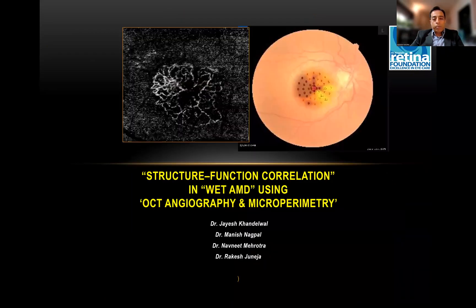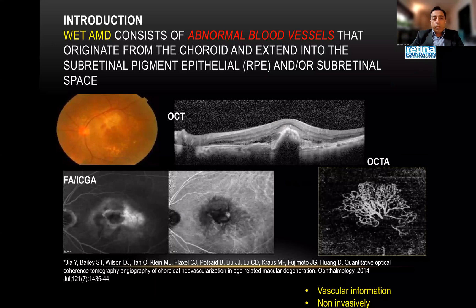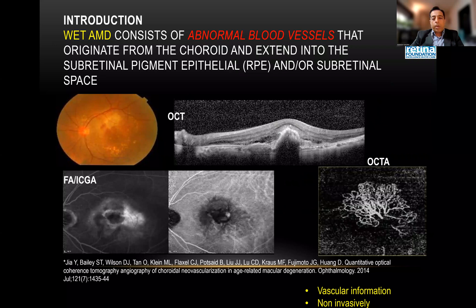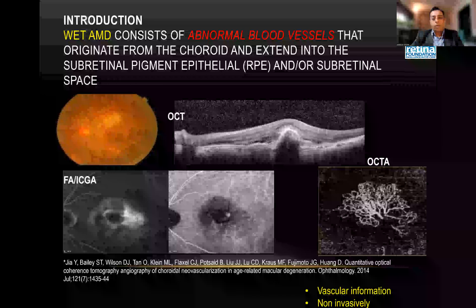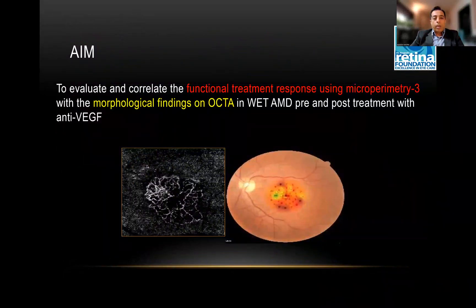I now move on to a brief aspect of microperimetry — a structure-function correlation in wet AMD using OCT angiography and microperimetry. Wet AMD consists of abnormal blood vessels under the macula; we can make out on the OCT angiography these networks which confirm the presence of an active network. We aim to correlate the functional treatment response using microperimetry with the morphological findings of OCT in wet AMD.